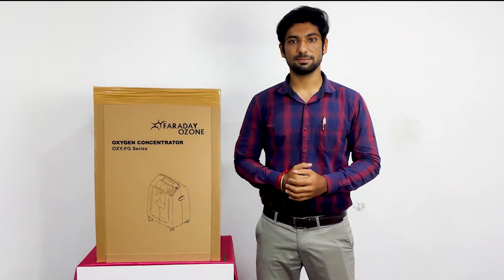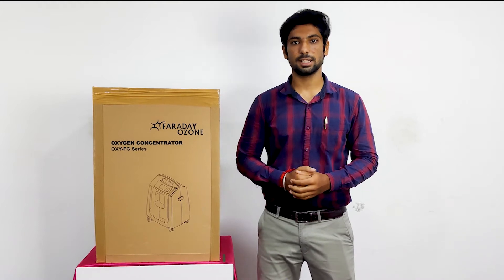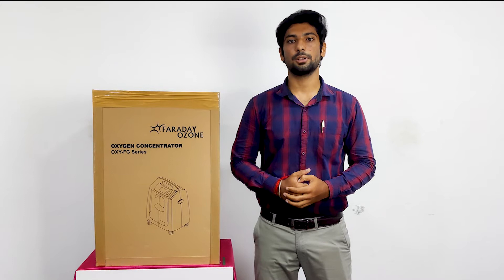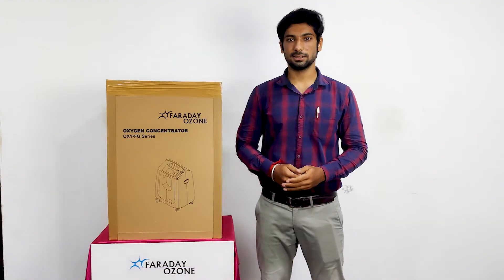Hi, good day everyone. This is Ilango from Faraday Ozone. In this video, we are going to see the unboxing of Faraday Ozone's 5LPM Oxygen Concentrator. It is OXYMO. Let us see the unboxing.